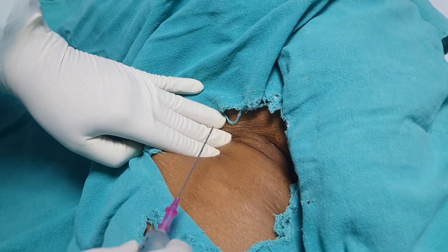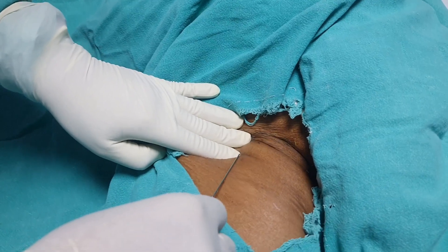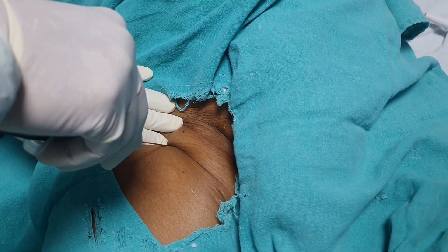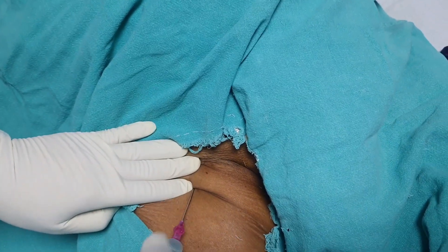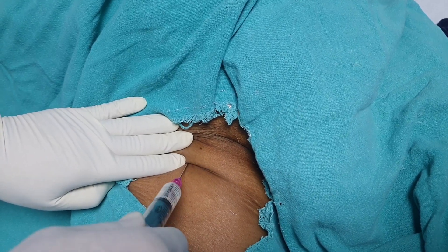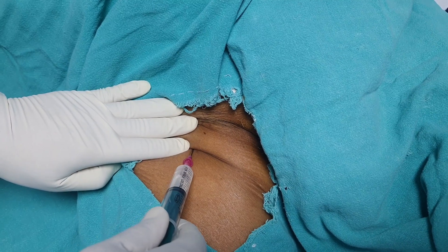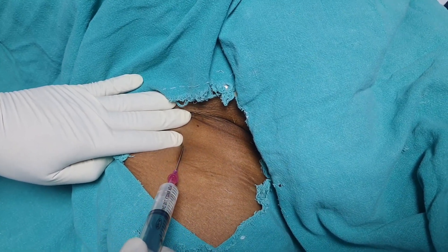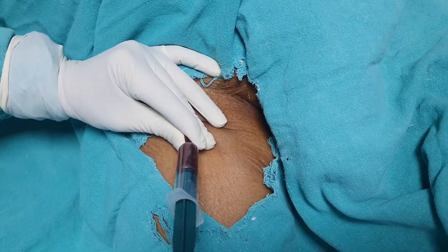After that we will take the 18-gauge needle which comes in the dialysis set. We will take 2 to 3 ml of normal saline in the syringe and insert at a 45-degree angle, applying negative suction to see whether blood is coming or not. Once going inside, if no blood is coming we can withdraw. Now blood is coming — so now we have punctured the femoral vein.